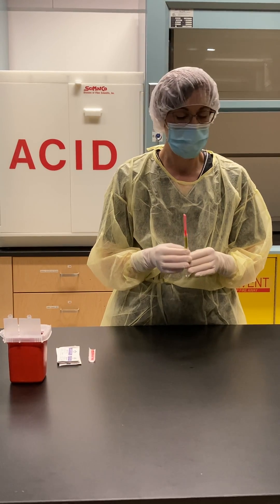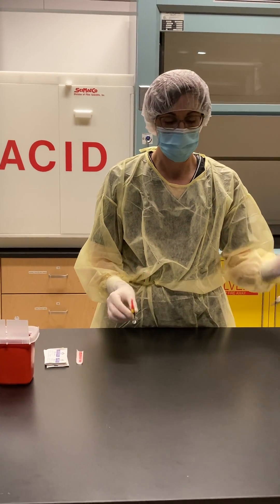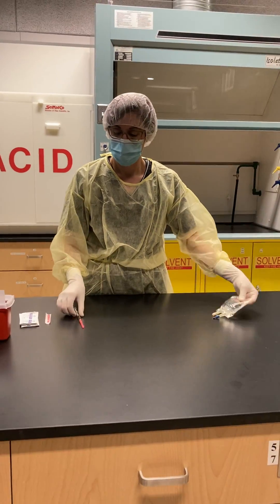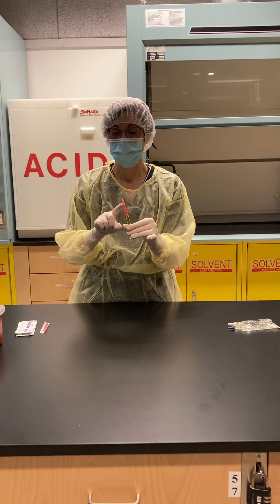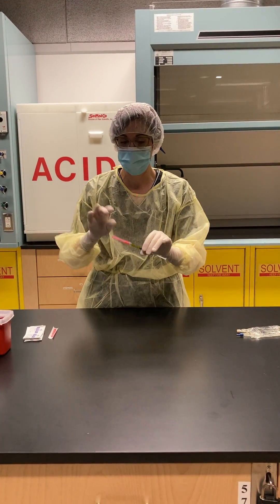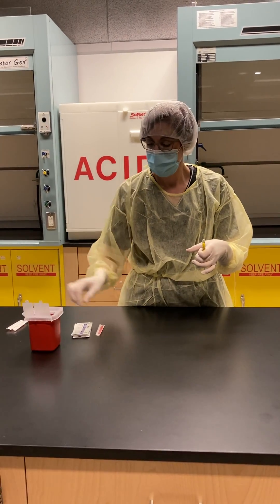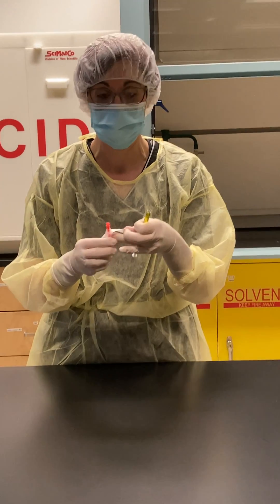Now we are going to practice adding medication into a mini-bag. I'm going to first change my needle that was used when I drew up the drug into my syringe. This just helps maintain sterility of your CSP.